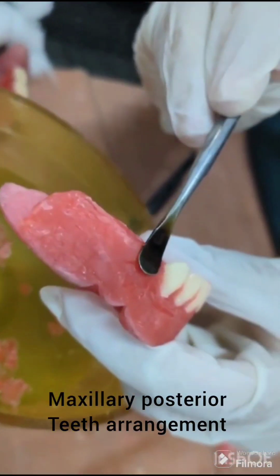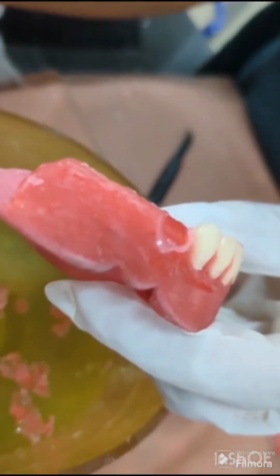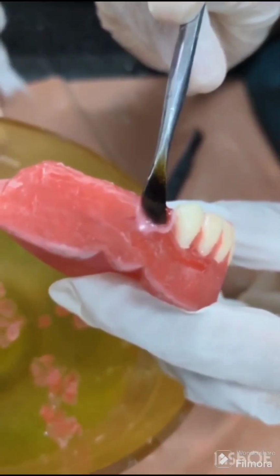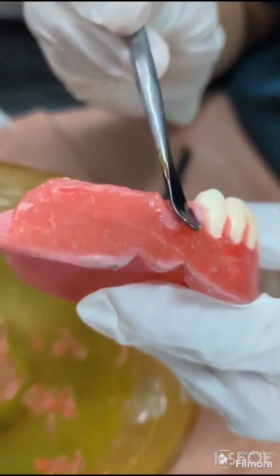Now moving to the posterior teeth arrangement. Arrangement of the maxillary first premolar. The long axis is parallel to the vertical axis when viewed from the front and the side. Its buccal cusp contacts the occlusal plane. The palatal cusp is slightly above the occlusal plane.